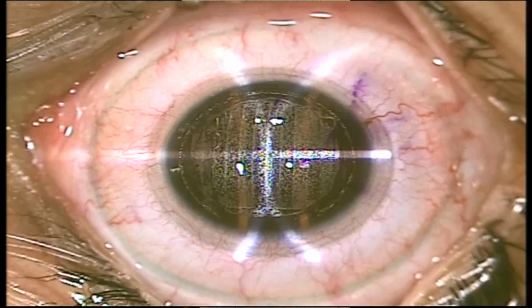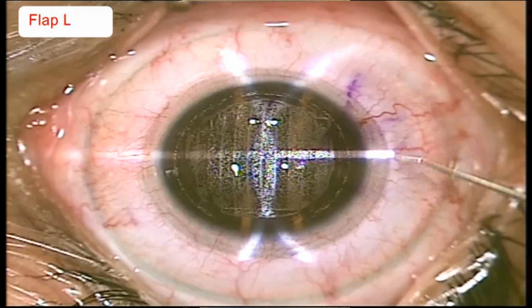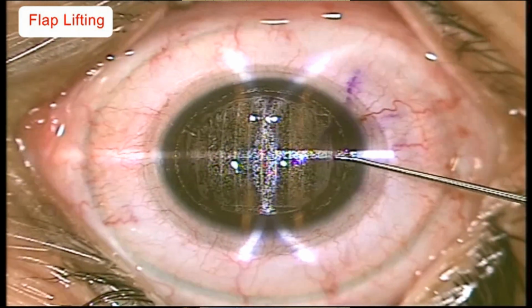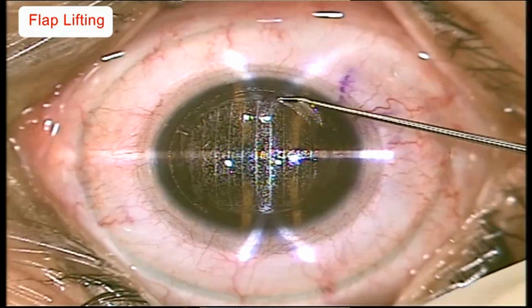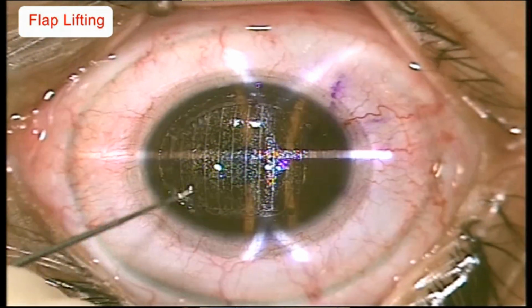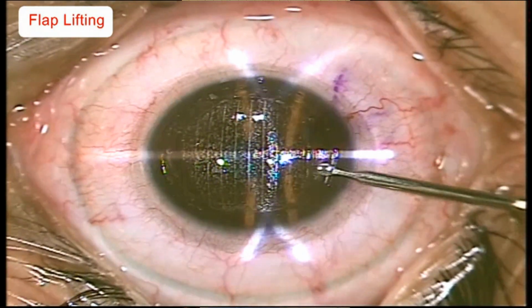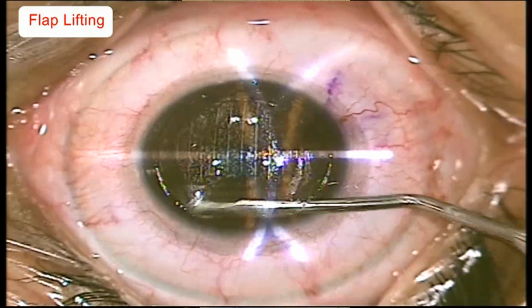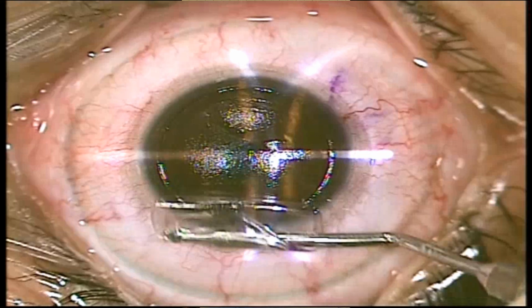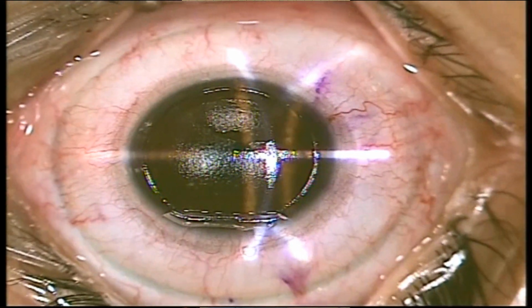Go on to a higher magnification to look through the cornea, and initially you have a separator which goes in and finds the plane. This is the plane between the layers, and once you've entered that plane, you can enter on the other side. You lift that up where the flap is, and then with the irrigating spatula, you go in from superiorly, go inferiorly, remove all the adhesions, and then nicely lift up the flap superiorly. Once that is done, you're ready for your laser.